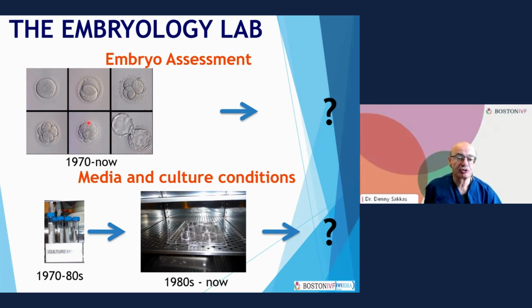Luckily, now we're able to culture embryos to much later, to the blastocyst stage, and that's nearly all our patients here. We now normally transfer only 1 embryo back to patients in about 90% of our cases, and in general in the US, that number is quite high.